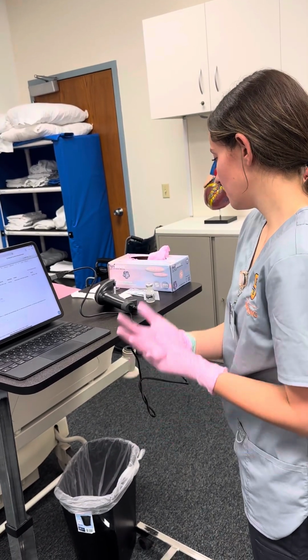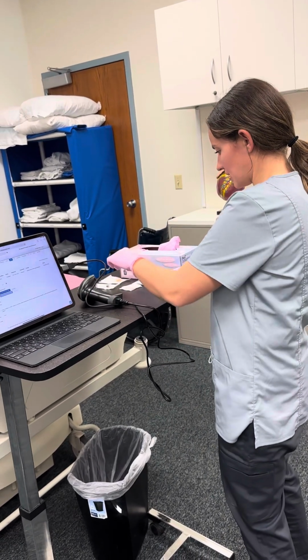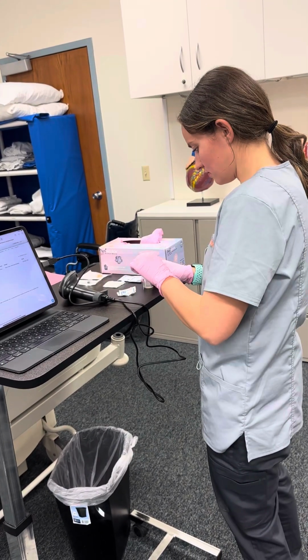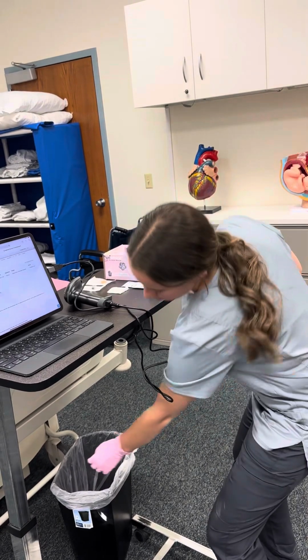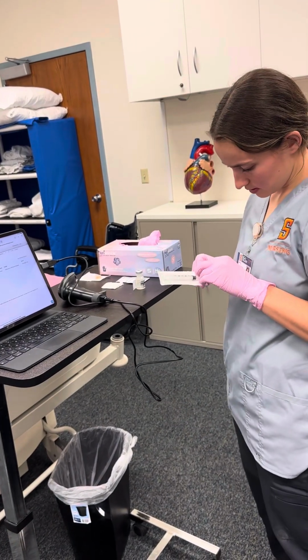Okay, perfect. So I'm first just actually gonna wipe down the top of the medication vial right here in a circular motion. I'm gonna let that dry. Throw that away. Get everything else prepared.